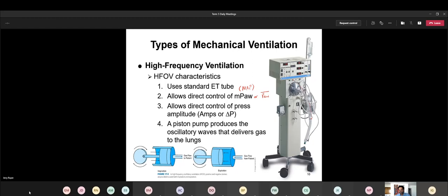How do some companies get around the problem of knobs getting off center over time as you're constantly turning them? Some companies, especially the ones that make transport vents, I don't know exactly how it works, but they'll tell you that after so many times of use, you should take all the knobs, turn them to their max, and turn them back to their minimum settings, and do that a few times.